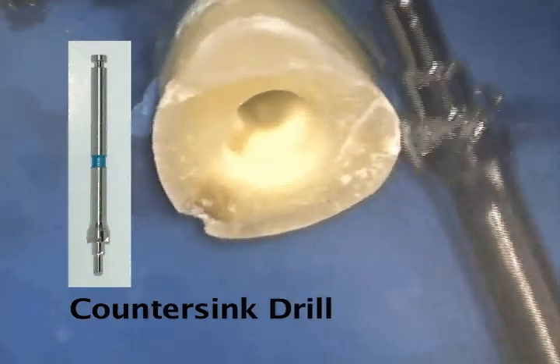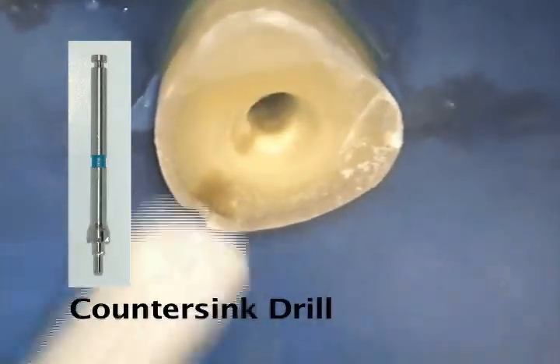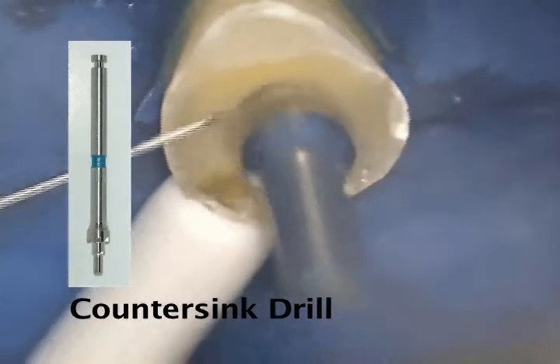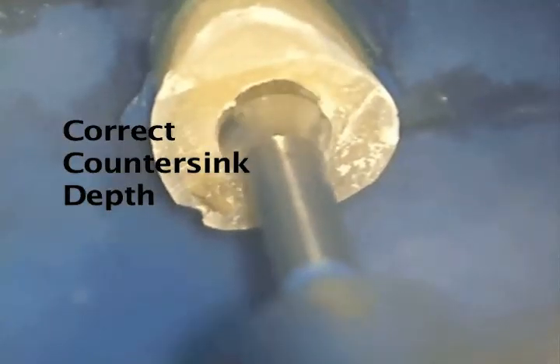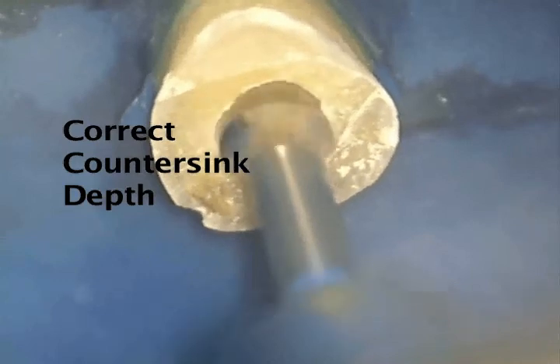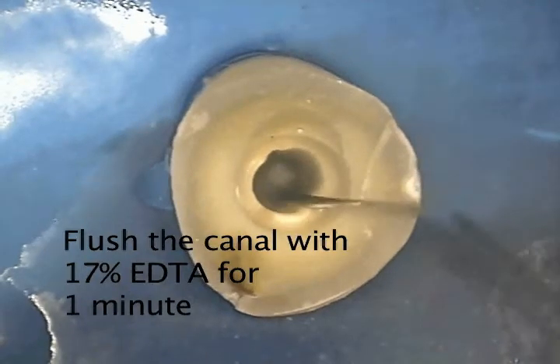The blue countersink drill is now used to make the preparation for the countersink and second tier in one operation. Always cut wet. It is also easier to use the smaller countersinks first — go in sequence and end with the countersink for the post size you are using. Cut into the coronal dentin until the area on the drill that starts to taper is flush with the coronal dentin, a depth of approximately one millimeter.